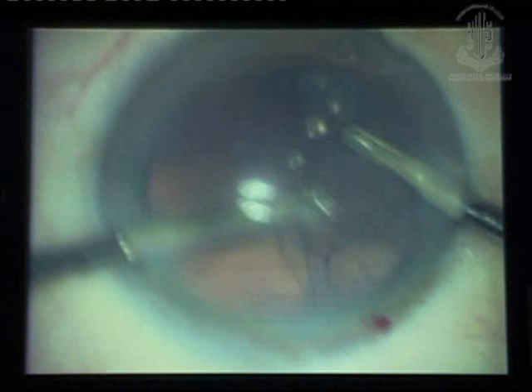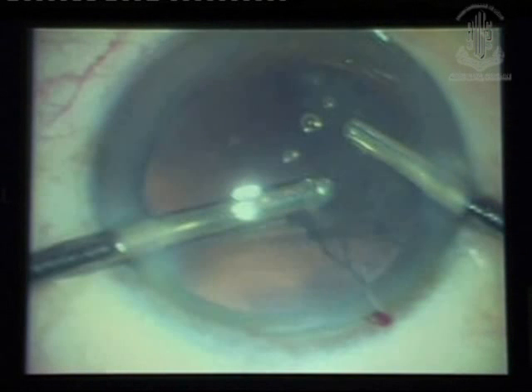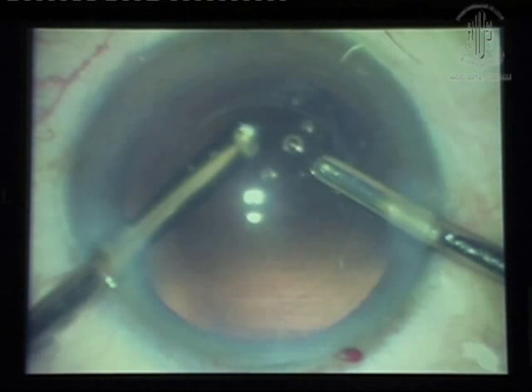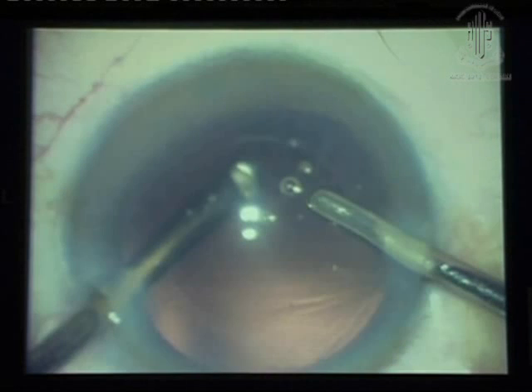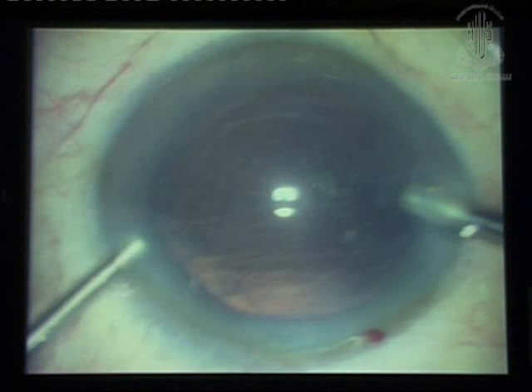Again, now inject viscoelastic under the iris, between the rim of the anterior capsule and the iris, to create space.